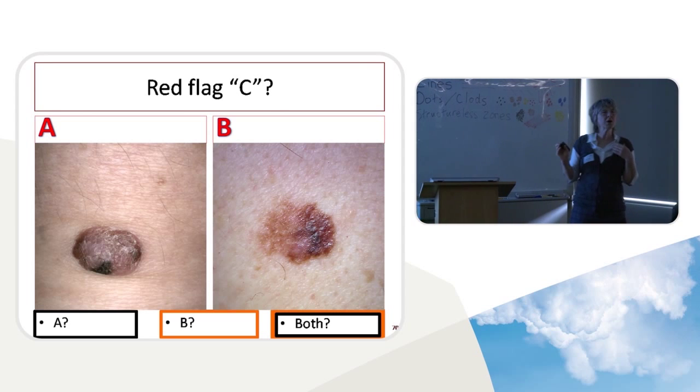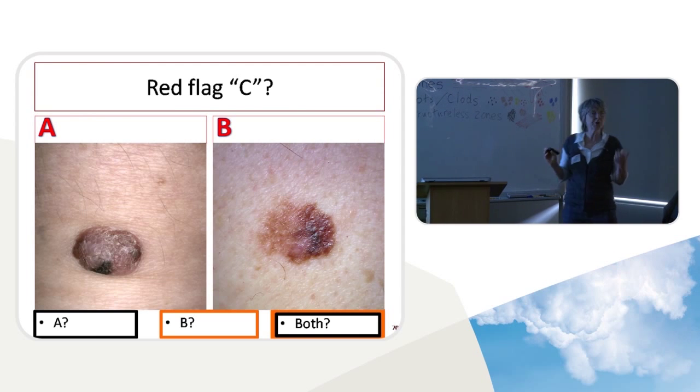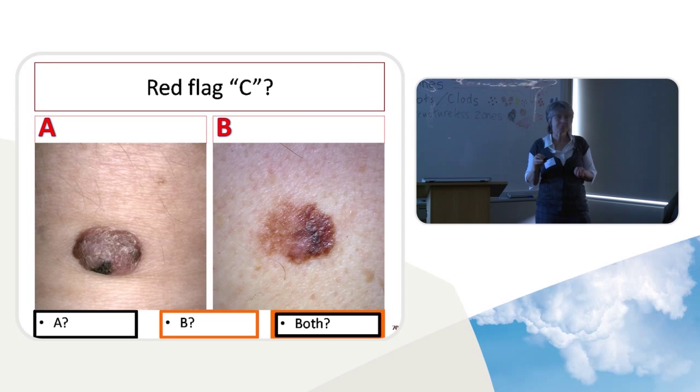If we say, well, what are the colours? In a clinical view, as we're seeing here, we can see several shades of brown. You're only allowed 2 shades of brown. So we've got light brown and dark brown. We've got a little bit of black focused here. And this has a light brown and dark brown, a sort of reddish tinge, and some black as well. So multiple colours is helpful. And the more colours, the more likely that you have an invasive cancer. So early melanomas may only have 1 or 2 colours, actually 2, they're always going to have 2. But in an invasive melanoma, more colours are going to come in.